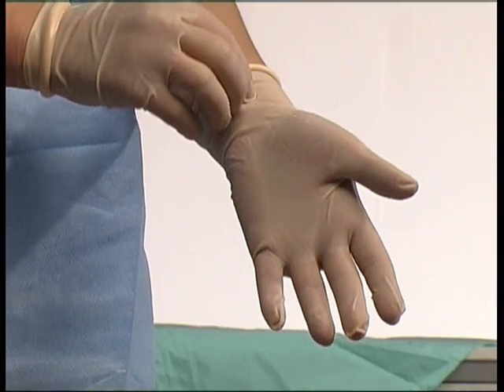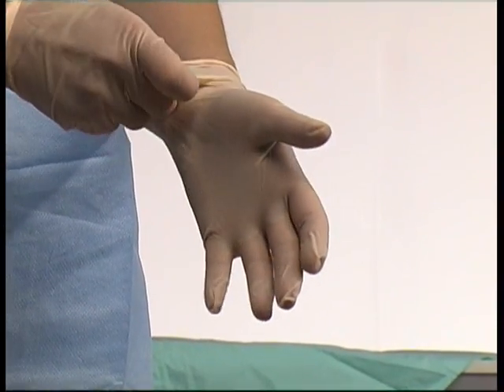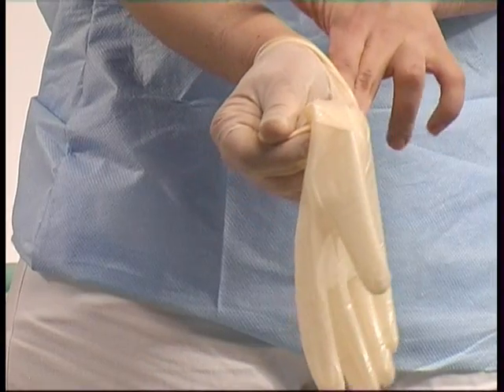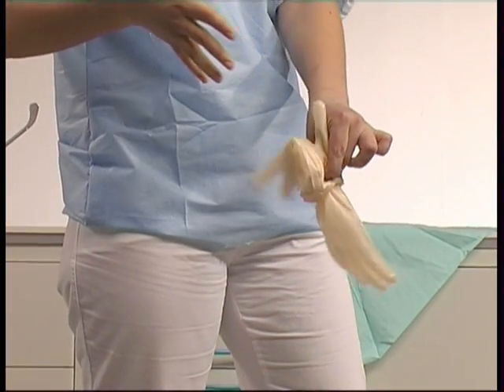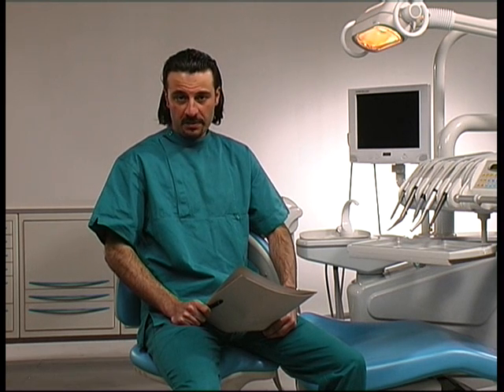The gloves must be removed, avoiding contact between the external side and the skin. The mayo cover may be used as a waste disposal bag for drapes, gowns, and gloves. The procedures shown are simple guidelines. With the same main aim of creating an aseptic environment, your own experience may require a modification of the protocols.